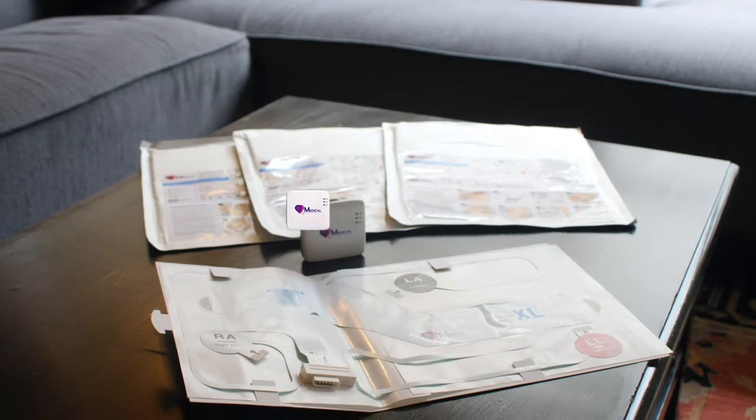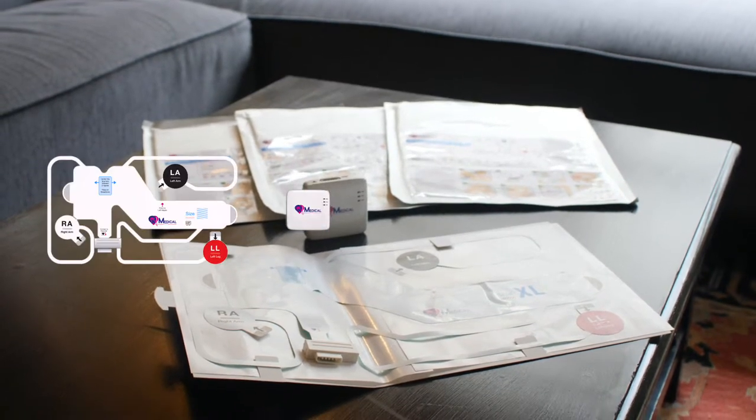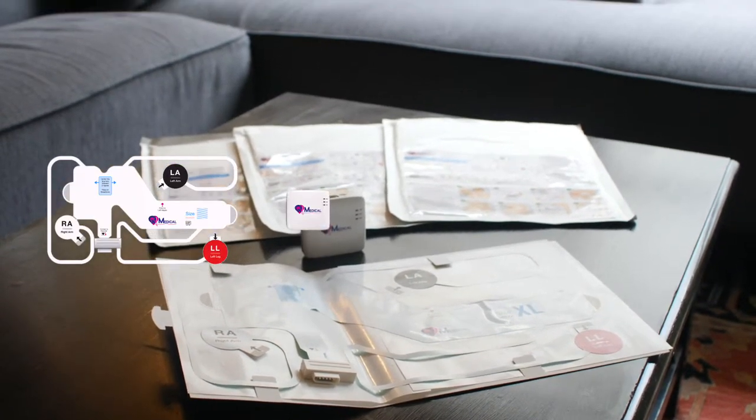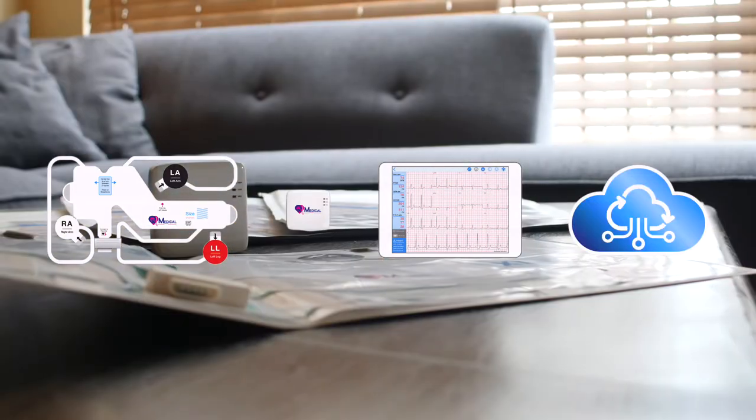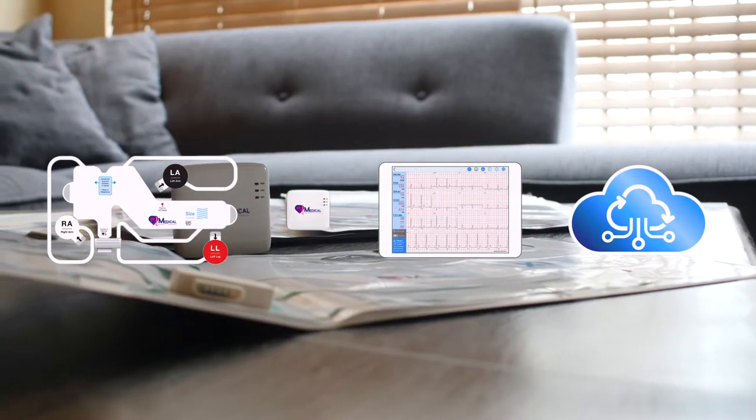QT-ECG includes a compact ECG recorder, a pre-positioned electrode strip, a user-friendly app on iOS and Android devices, and a secure cloud server for cardiologist interpretation.